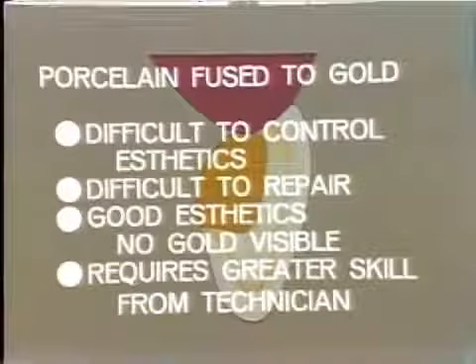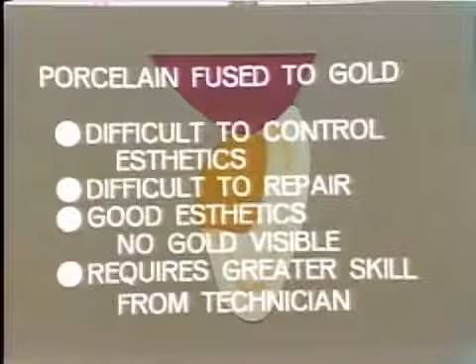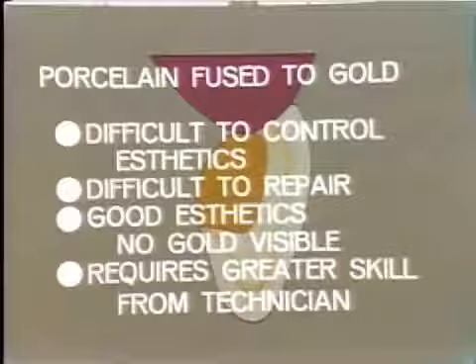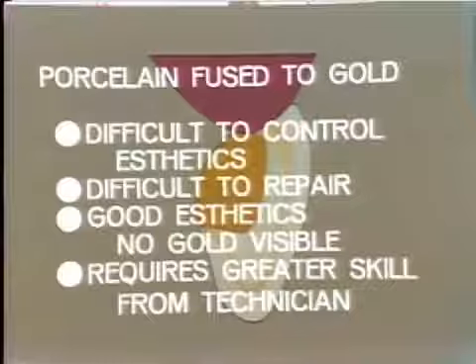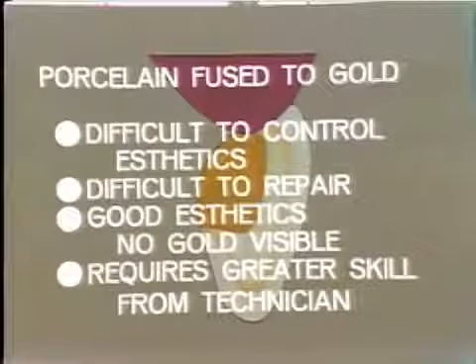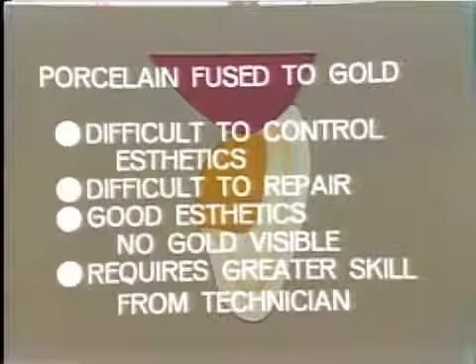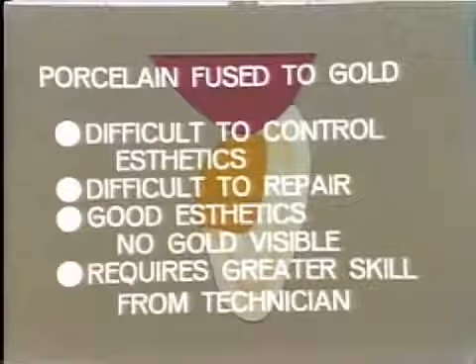When they do break, it's generally necessary to remove the bridge from the mouth in order to effect a satisfactory repair. The aesthetics of these cases can be extremely good if they're well done and carefully controlled, with the great advantage that no gold need show at all. They do require greater skill from the technician, both in the development of the gold core to its correct and effective shape, and also in the blending and the molding of the porcelain to the correct mold and the correct shade.